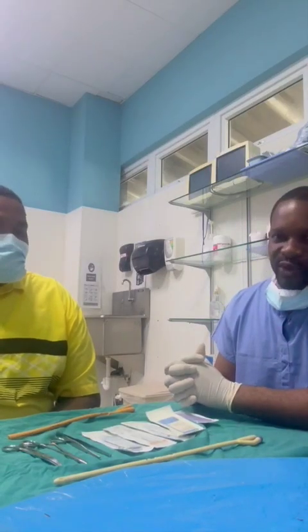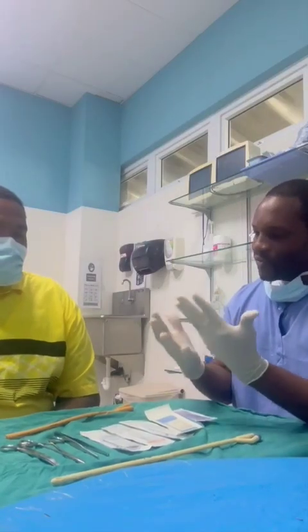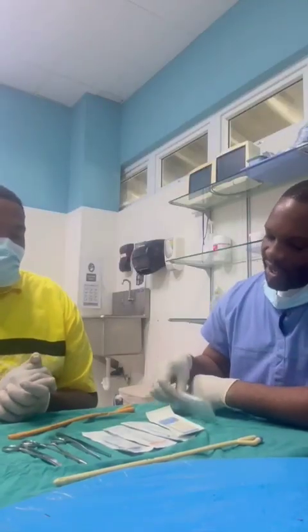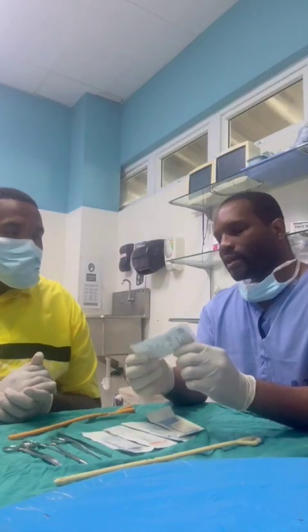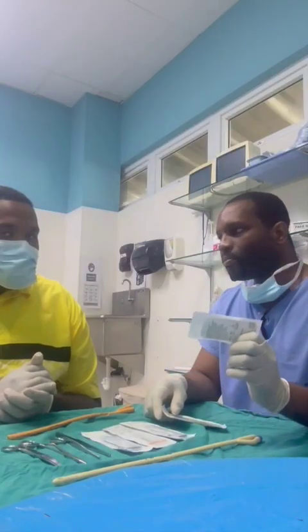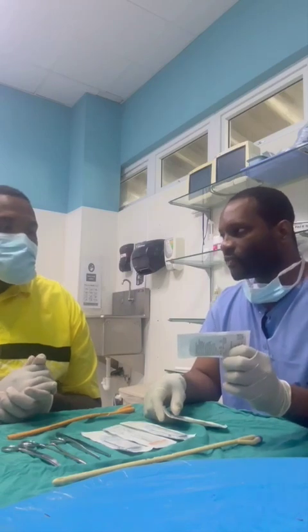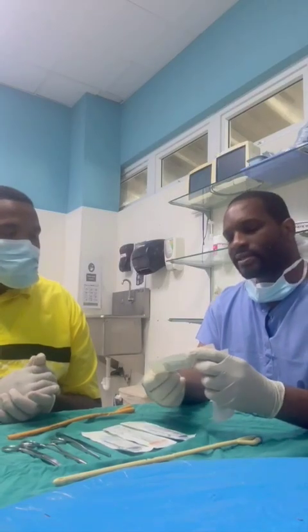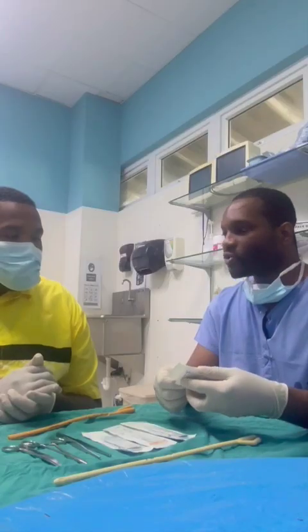Very good. So now what we have here today, you have a pair of surgical gloves, do you? Yes, I have. Excellent. So we have a vicryl suture. This is an example of a polyfilamentous and absorbable suture, meaning it will dissolve in the tissue itself. Here is Mersilk. It is a non-absorbable suture, and it is natural. It comes from the silkworm.